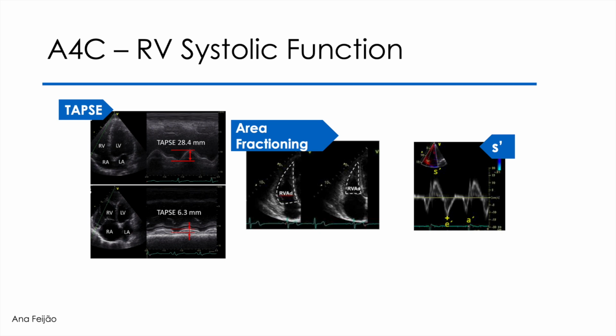To calculate tricuspid systolic velocity, I place the PW cursor over the tricuspid ring, also aligned with the movement of the ring. Don't forget that it is angle dependent. The PW sample should be approximately 5 mm and the gains and filters should be changed to a lower level. I activate tissue Doppler by pressing the PW command again and evaluate the velocities of the tricuspid annulus, very similar to the protocol used to evaluate the spectral graph of the velocities of the mitral annulus.